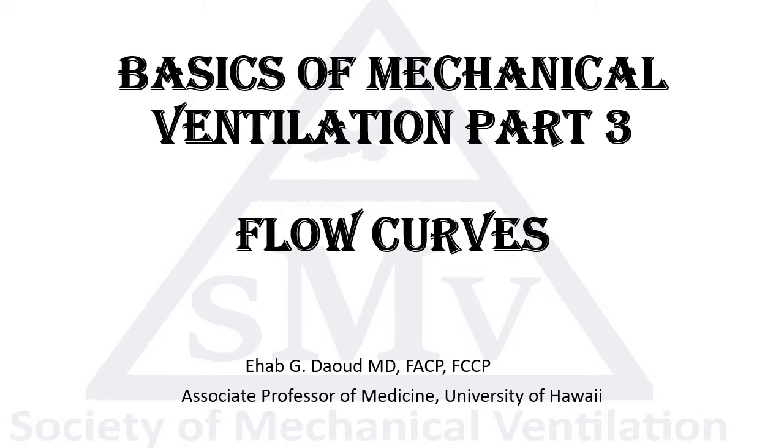Basics of Mechanical Ventilation, Part 3. Flow curves and their importance.